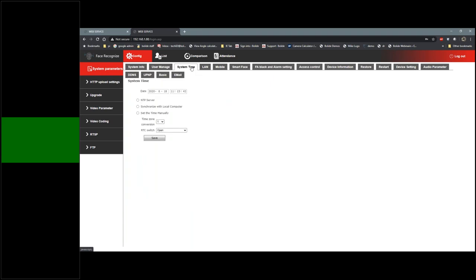System time — make sure you change the date and time. That's crucial. We've seen customers not adjust the date and time and their searching will be off. Just make sure that you make this correct first.